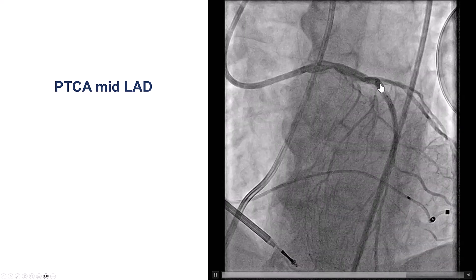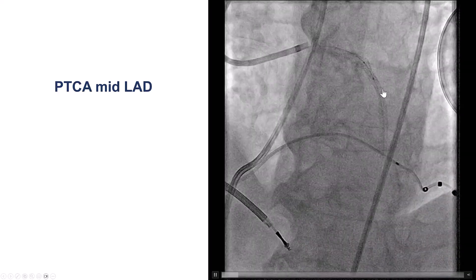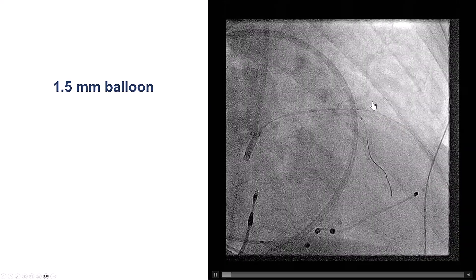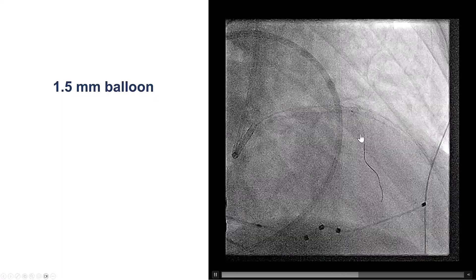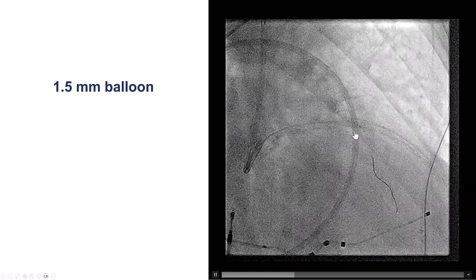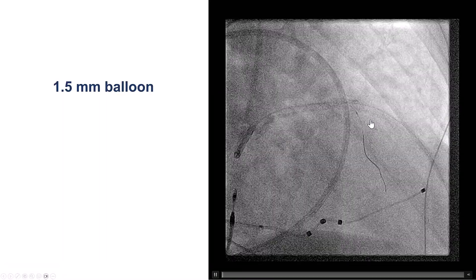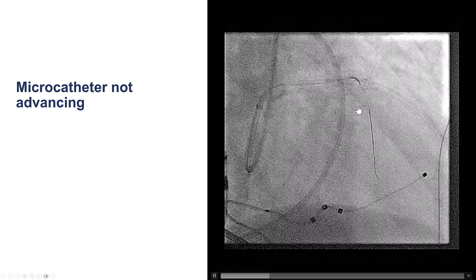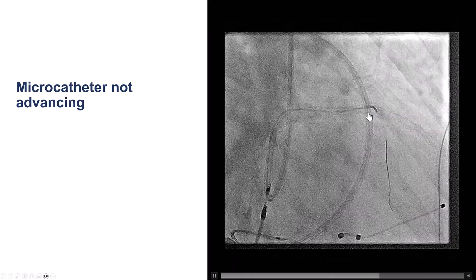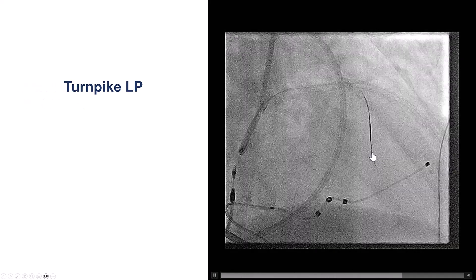Before doing that, we performed balloon angioplasty of that mid-LAD lesion, since we want to minimize any risk for ischemia. After doing that, we advanced a guidewire into the septal branch, and because of the previous stent into the LAD, we did inflation of a 1.5 mm balloon. Despite that, we had some difficulty delivering a microcatheter into the septal, but after switching to the Turnpike LP, we were able to advance into the septal branch.